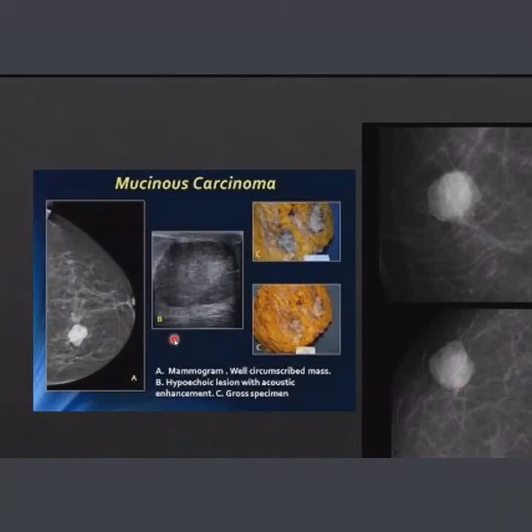So for you, don't judge. If a relative or someone asks you, you're looking at what looks like a benign or circumscribed mass, just don't say okay, this is circumscribed, this is not cancer. But you must know the general rule. Generally speaking, a speculated, irregular, ill-defined, ugly mass is a cancer, and a well-defined, rounded mass has more likelihood of benignity.